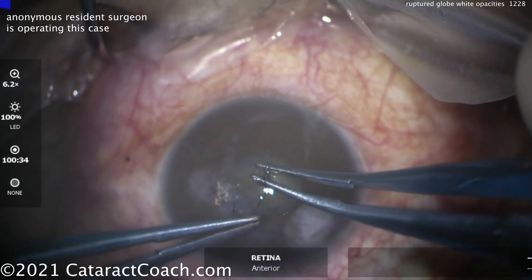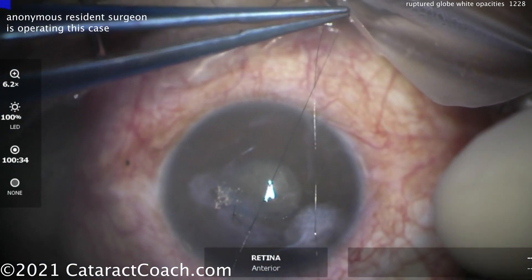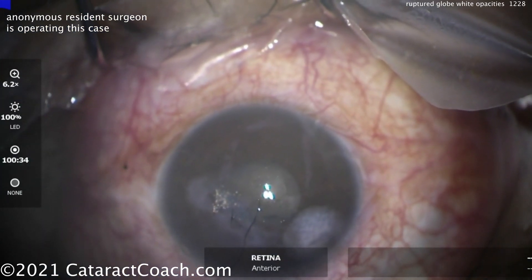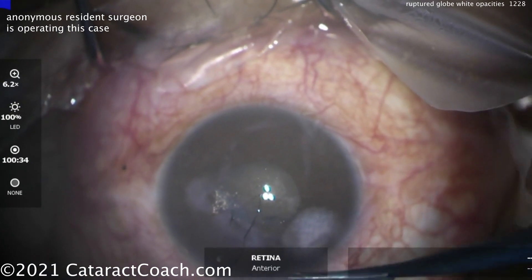Once you've got it sutured up and think it's watertight, you can do a Seidel test. This patient is going to have, in the same surgery sitting, a pars plana vitrectomy and retrieval of the intraocular foreign body.